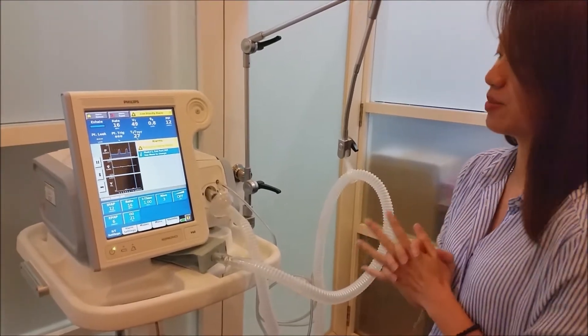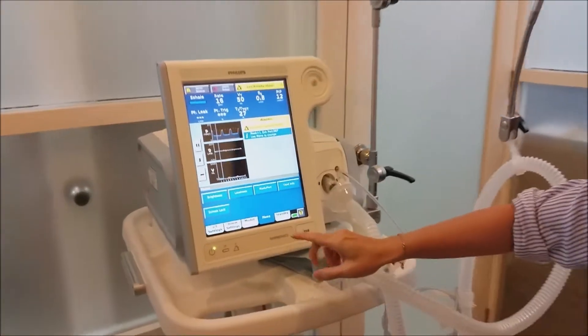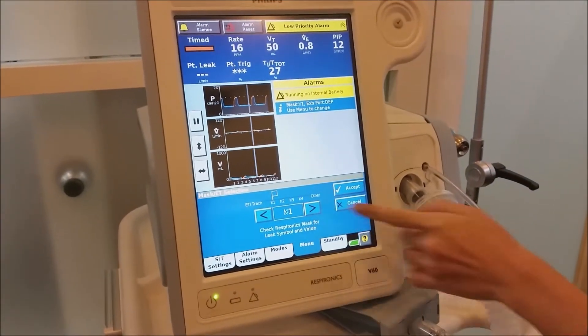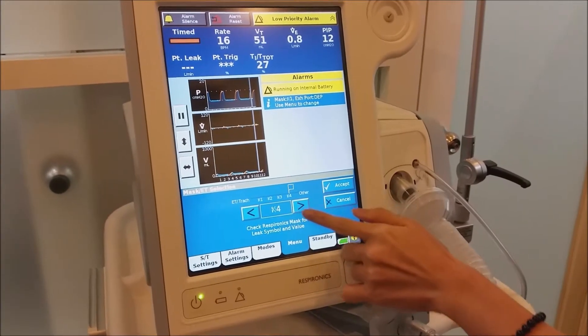However, for best practice purposes, you should go to the menu and then go into the mask/part section. Over here, you can see there are numbers: one, two, three, four, and other.